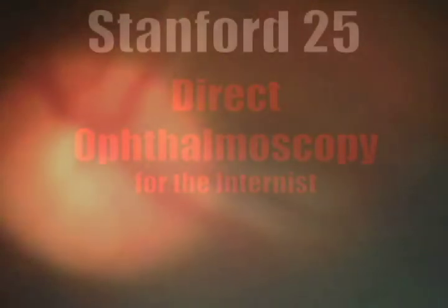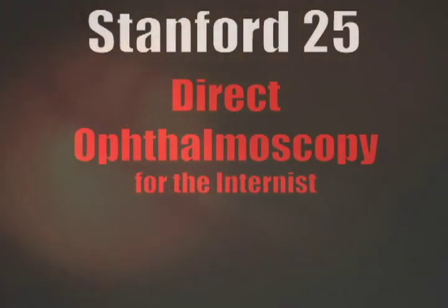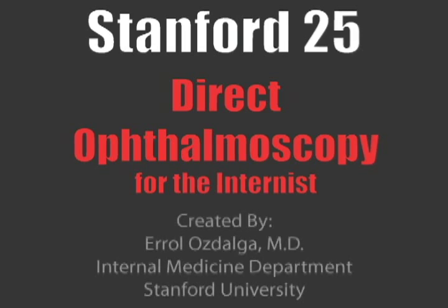However, when using the panoptic, you'll ask the patient to look up to look at the upper part of the retina, down to look at the lower part of the retina, medially to look medially, and laterally to look laterally. Finally, you can also ask them to look towards the light in an effort to see the macula.